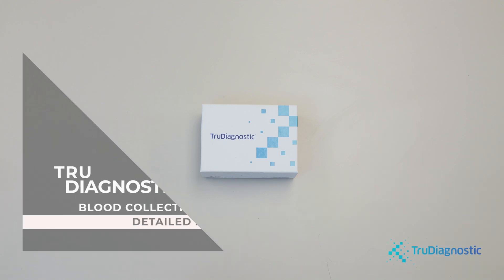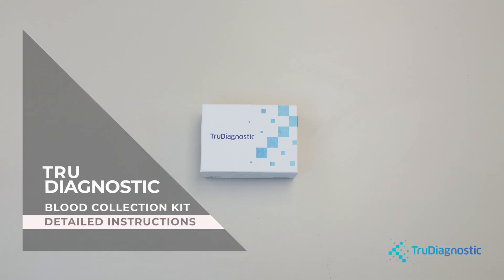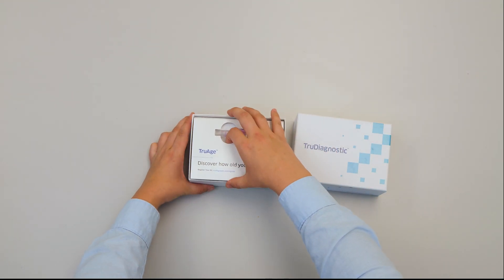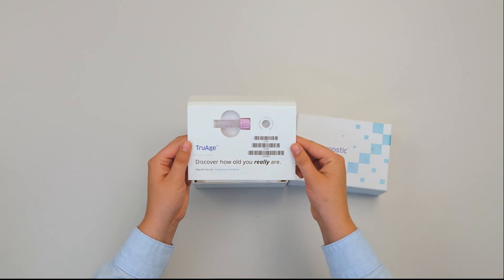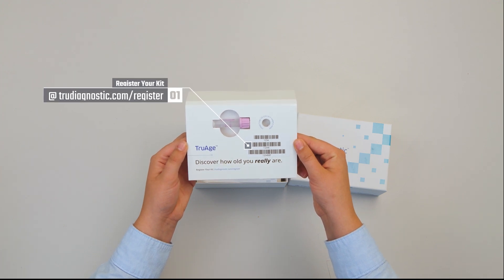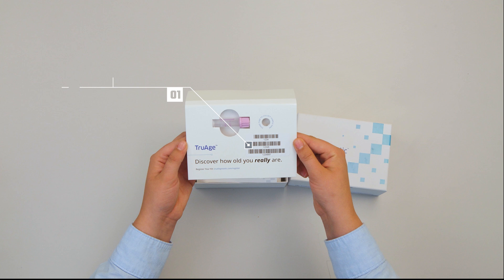True Diagnostics Blood Collection Instructions. Your sample cannot be processed unless it is registered, so please register your blood collection kit at truediagnostic.com/register.